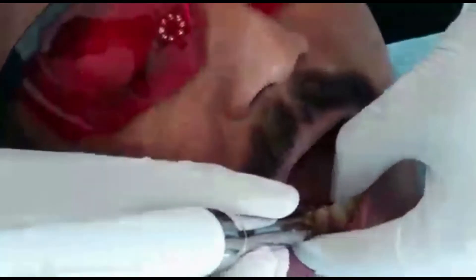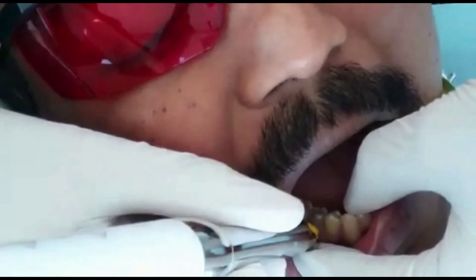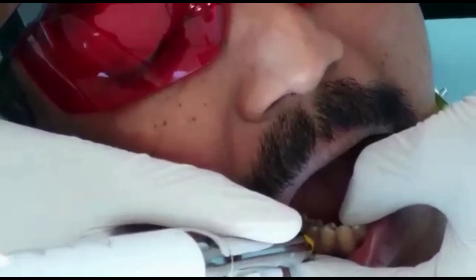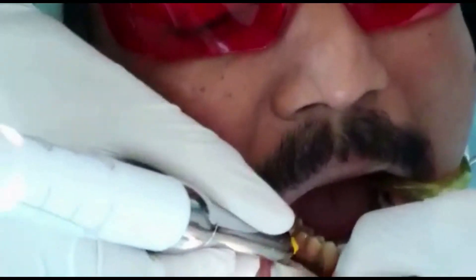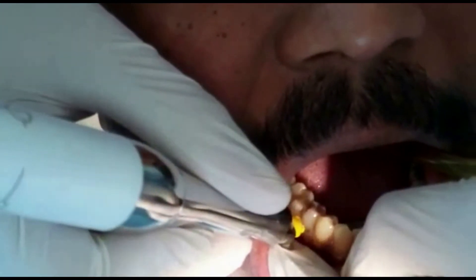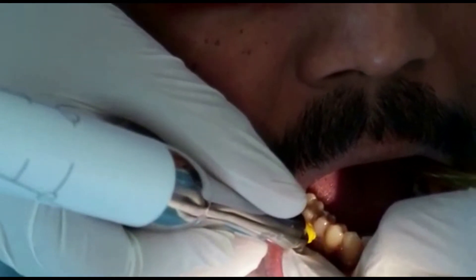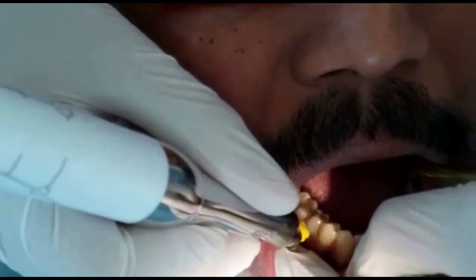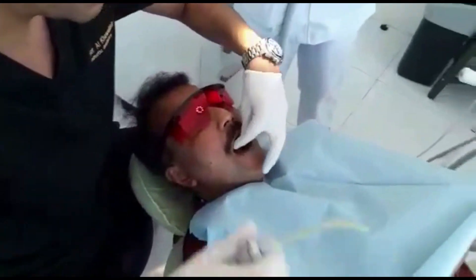I want to give you about half — let's say less than half. It's now a quarter. The first quarter means a quarter. Then I protect the lip with the lip retractor. I make sure that it's on the left side. Everything will be fine. Normally the tooth has sensitivity because there is an exposed root — we will see. I'll stop now, I will not give so much. I will put it out gently. That's it. Cover it.